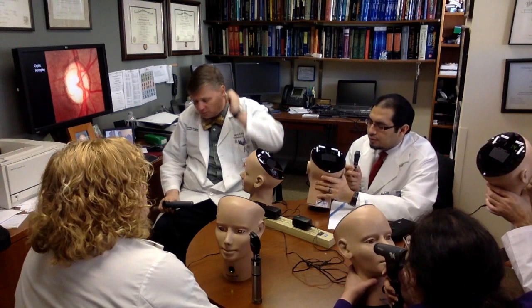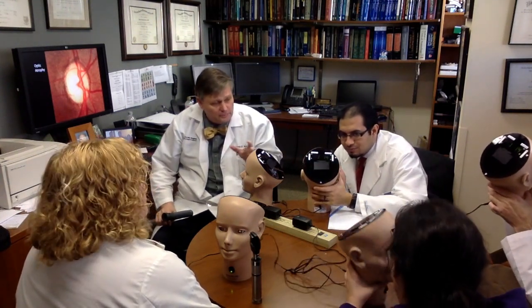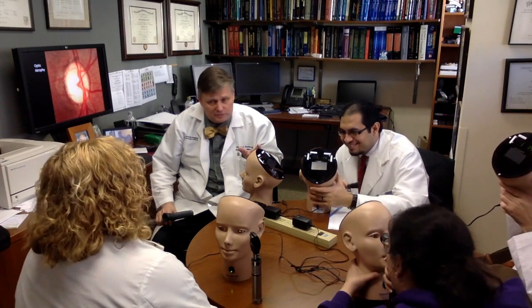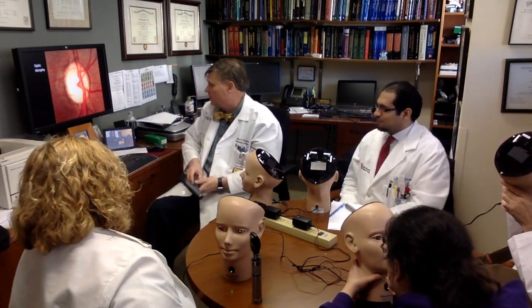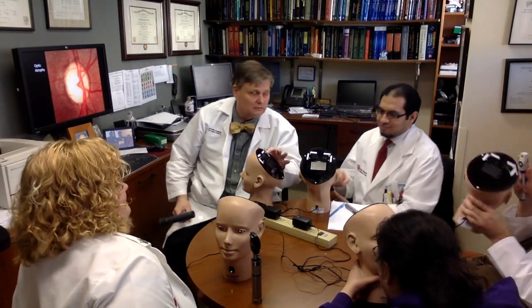You could just about guarantee if you see AV nicking in the retina, the same thing is happening in the kidney, the same thing is happening in the brain. Okay, so that's AV nicking. Let's go to number 15.